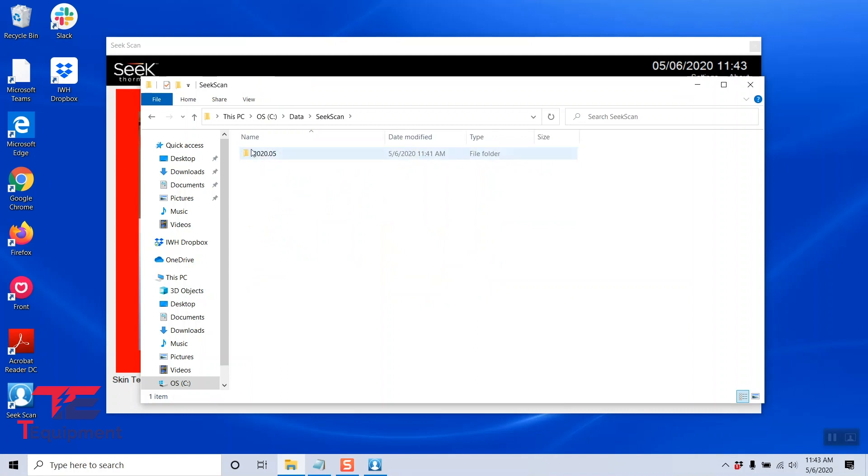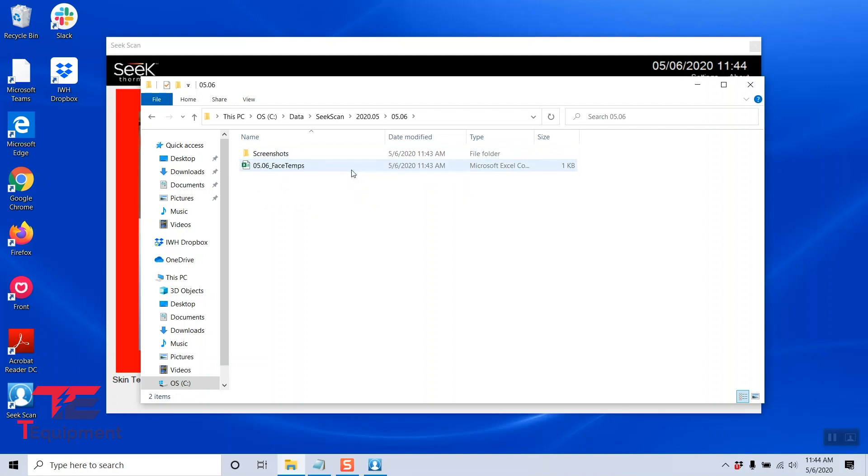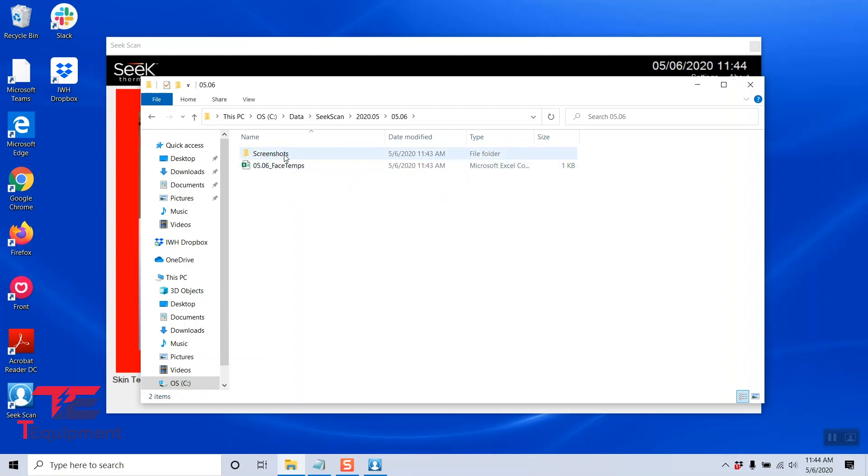And again, it will label them by the year and the month here, and again the month and day. And it's going to give me two different files. So one is the face temperature log, the other one is going to be the screenshots. I'm going to go ahead and open the screenshots.